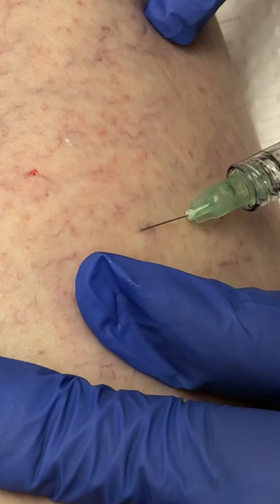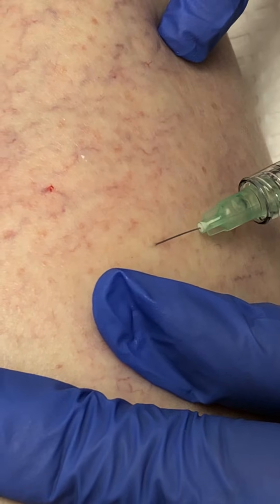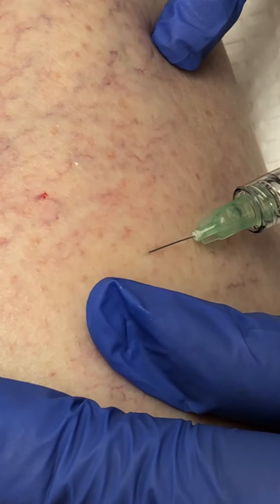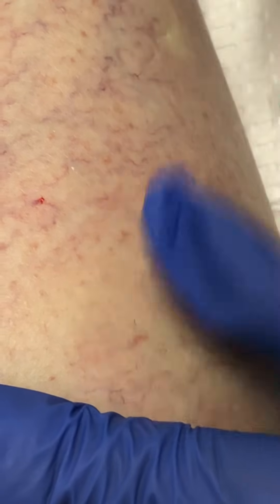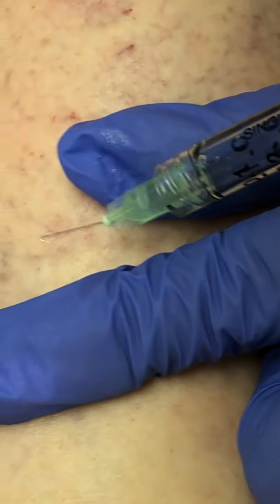Typically I have a nurse following me who immediately puts a little compression along these little pinpricks. It serves a few purposes: it prevents bruising, and it also prevents superficial thrombus formation.